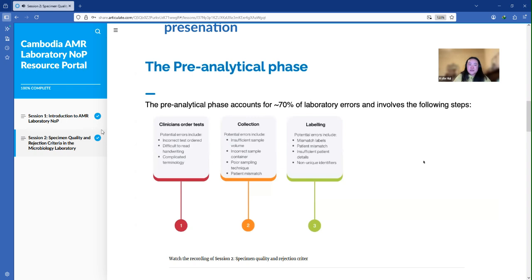So how this system works is when you're looking at your gram stain at a low power field, if you can see greater than 25 neutrophils, this will be a score of +2. If it's 10 to 25 neutrophils in the low power field, it'll be +1. And if there's less than 10, it'll be a score of 0. Then you will look at the epithelial cells. If there is an epithelial cell count between 10 to 25, that is -1 point. And if it's greater than 25, it's -2. If there is presence of mucus strands, it's a score of +1.